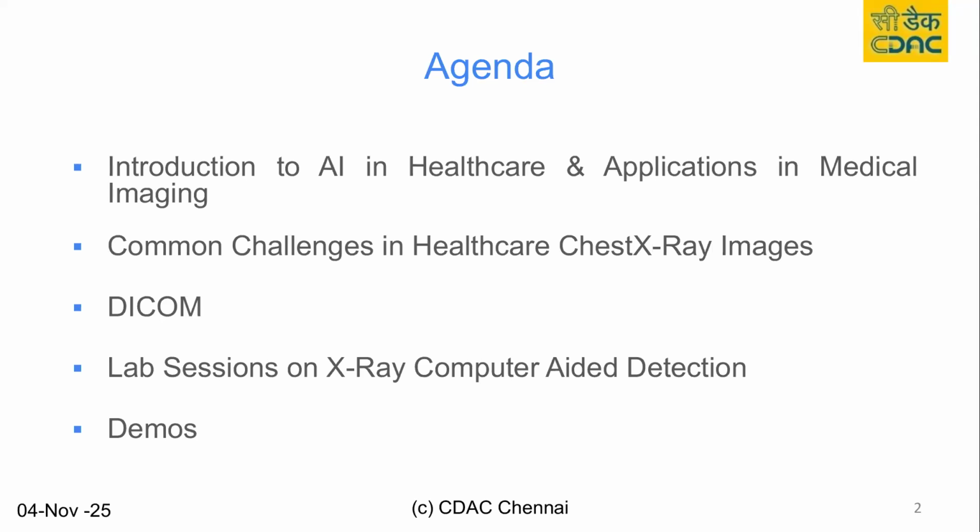So this is a standard used widely in healthcare for transfer of X-ray images. Any medical images. Similarly, there are some standards like EHR, Electronic Health Record standard. So the standards are there for any medical image communication part. For the imaging part, the DICOM standard is a worldwide accepted standard.